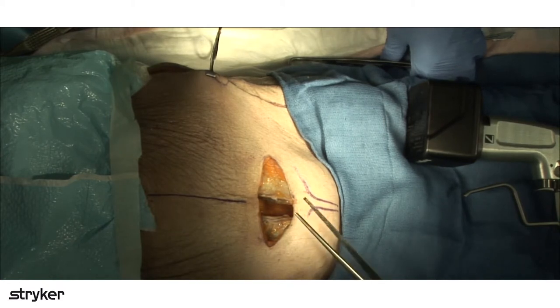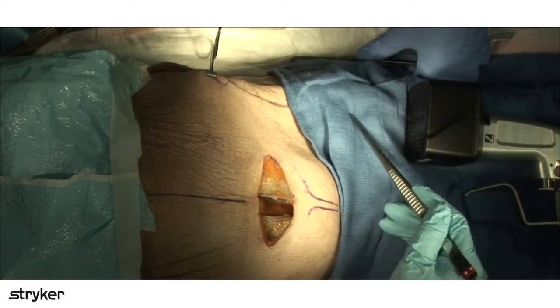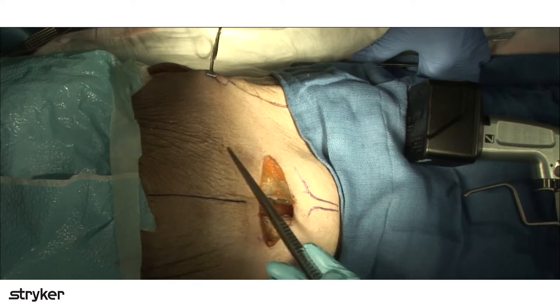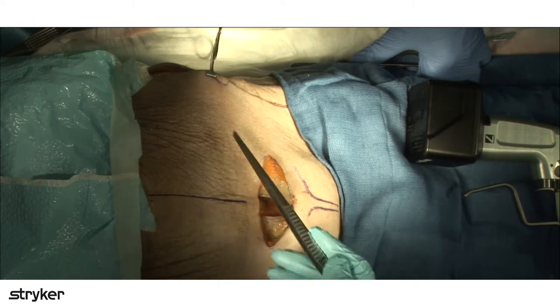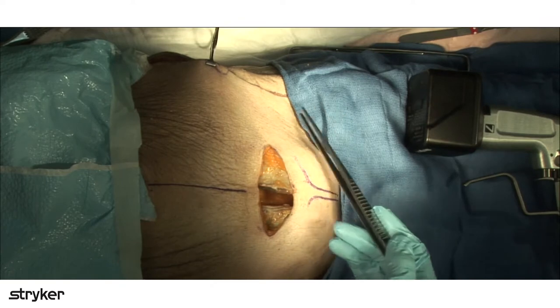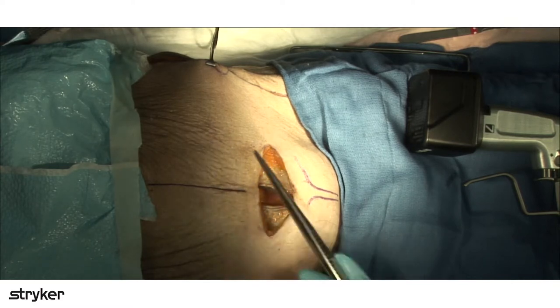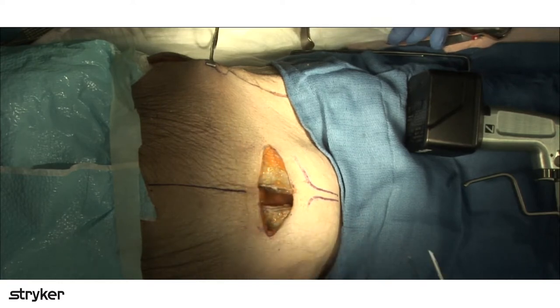So those two things are really important. You've got to get the femoral head out of the pelvis, and you have to really flex the hip. Flexing the hip allows you to maximize what you get out of this exposure because it relaxes the iliopsoas and the external iliac vessels. You'll see as we go through this exposure how much we have to retract those structures. If you have the hip extended and you have longitudinal traction, you're really tightening the iliacus and the iliopsoas, and it's going to make it really difficult for you to get in underneath. So that's even before you've made any incisions.